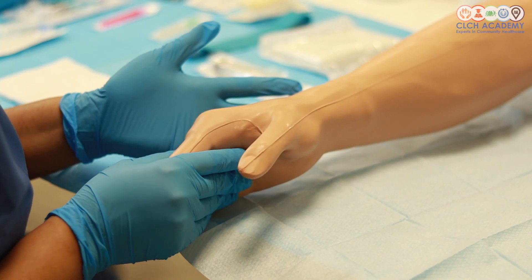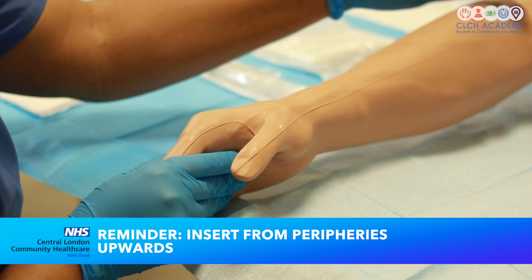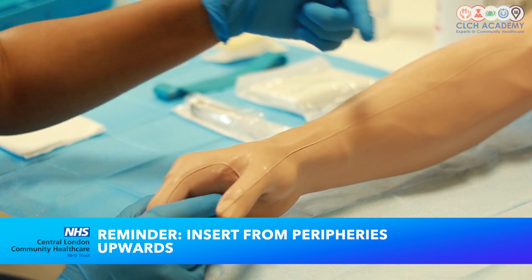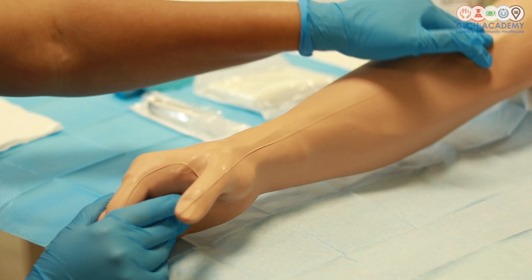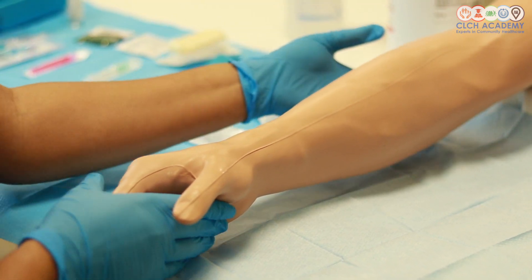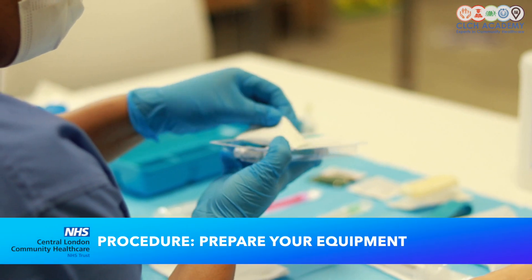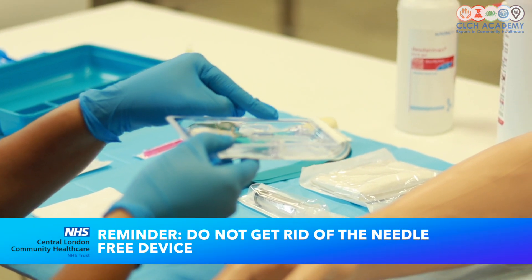The thing to highlight about cannulation is it is about moving from the periphery strategically upwards in terms of the insertion of the cannula. That allows the vein to maintain its integrity as much as possible, and you can always move upwards to the next element of the cephalic without having a hole at the top meaning you'll get leakage when you introduce fluid replacement. So in this situation I'm probably going to be headed for the cephalic in this direction. I'm going to open my cannula — today we're using the Nexiva device. It's got the needle free device in there.